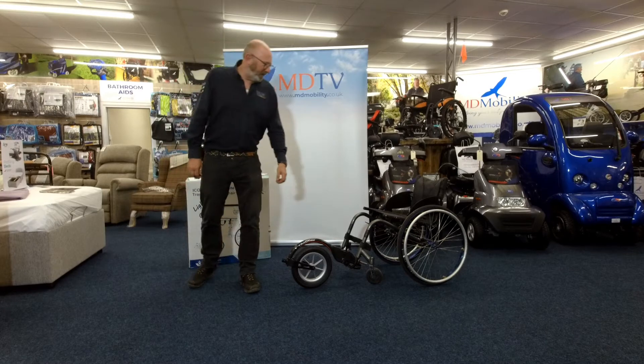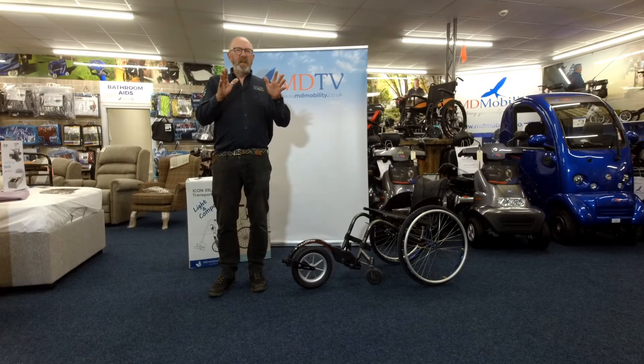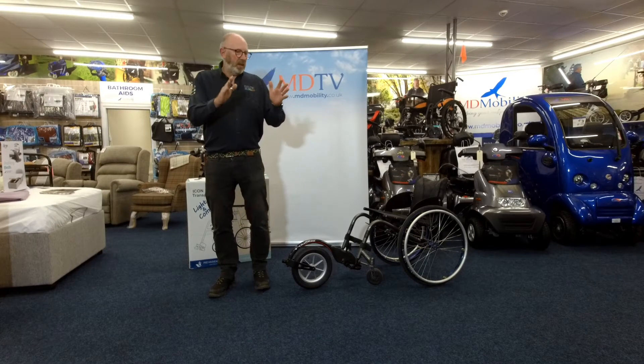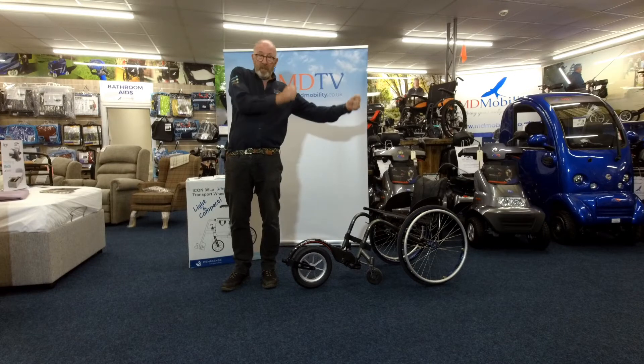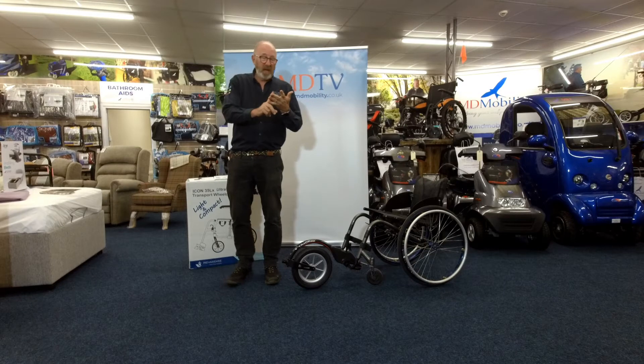Hello again, Alan from MDTV. Today we're going to show you something for the guys that have the sporty tight wheelchairs. You've got your wheelchair that you get yourself side transferred into the car, you take the wheels off, you pop it across in front of the steering wheel, you put it on the side — you know exactly the sort of thing I mean. It could be a Bromkin, it could be a Quickie, it could be a Coochelle.